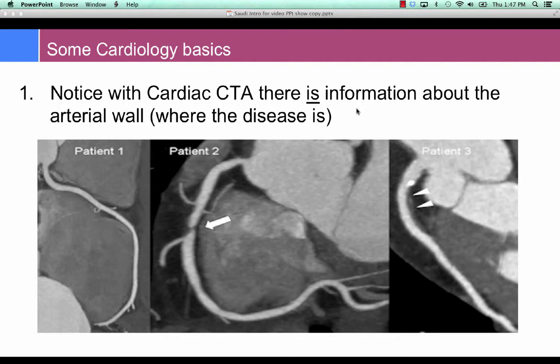The entire proximal segment of this coronary vessel, whichever one it is, exhibits an eccentric plaque, which is subsegmental, but it has areas of calcification. There might be a little staining from contrast in a plaque ulcer. This may be early calcification, but we have a lengthy eccentric, non-obstructive but complex plaque that harbors some of the elements of instability.